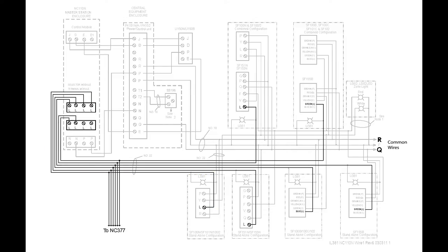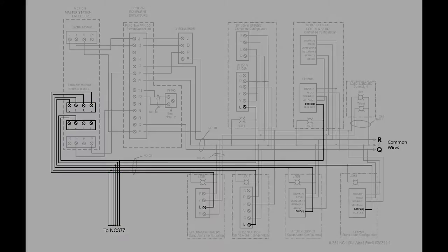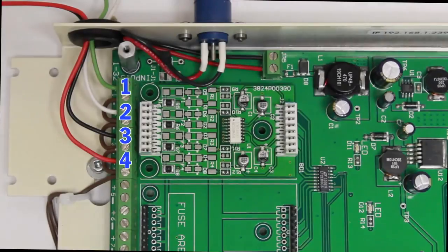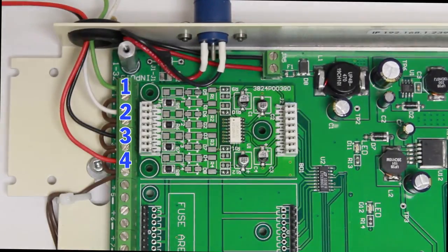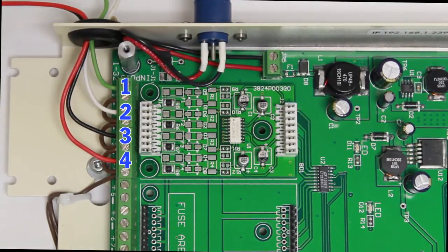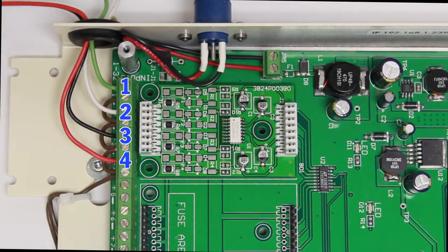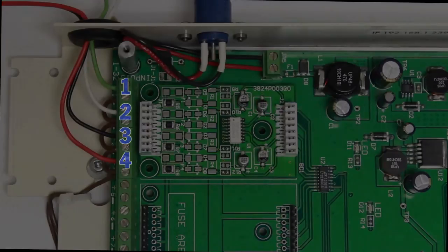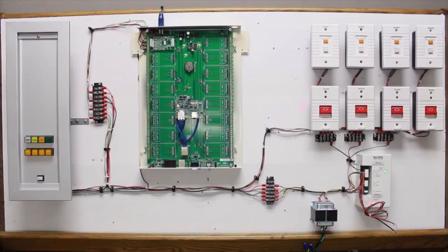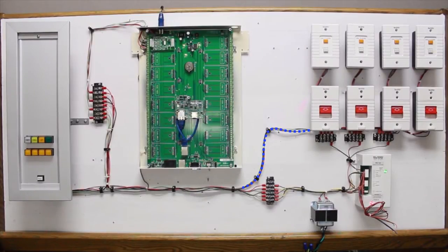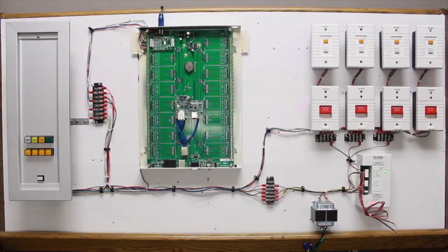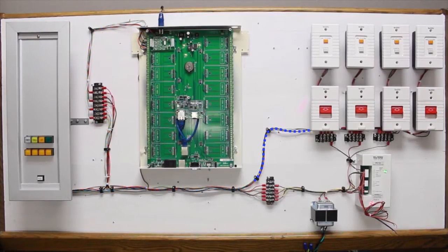You will tap into these select lines so that they can be monitored by the NC377. Each of these lines will terminate on an individual point and you will program the 377 to see that point as a unique zone or room. So when a low priority call is initiated the NC377 sees the voltage on its corresponding point go low and when a high priority call is initiated the voltage pulses.